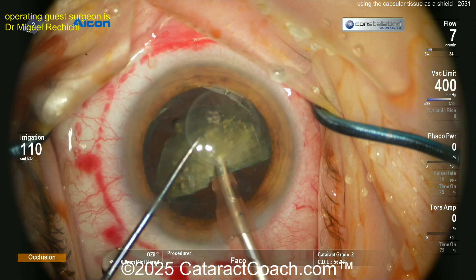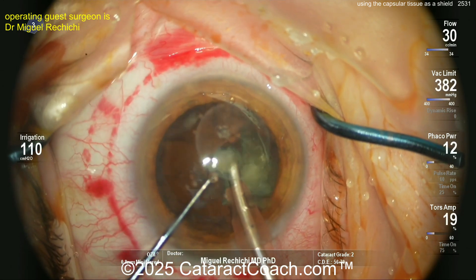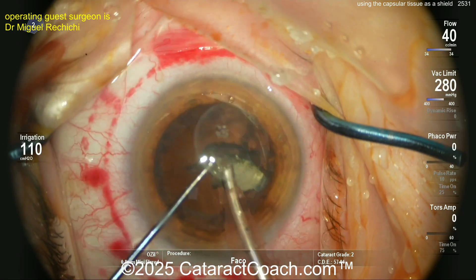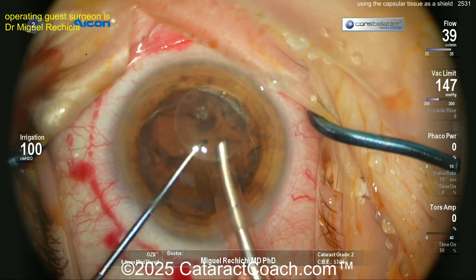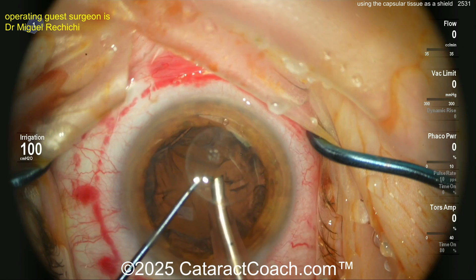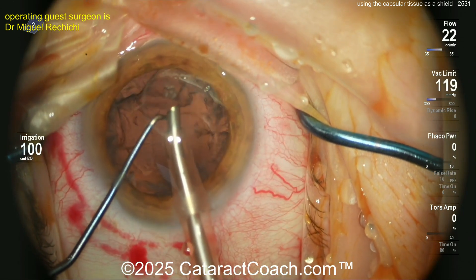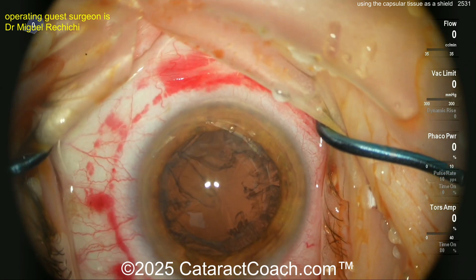The last bit of nucleus is coming out. Then the surgeon will aspirate out that central lens capsule that's up against the endothelium. You can see beautifully — there's the endothelium being covered, at least partially, by that small button. But remember, that button is only five millimeters in diameter and the corneal diameter is about 12 millimeters, so it's not clear if the protection is complete. And now — the capsule is gone.